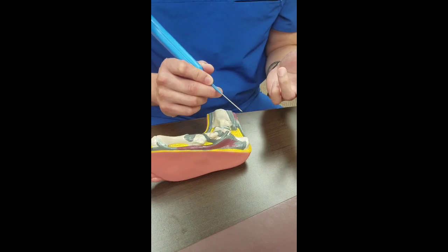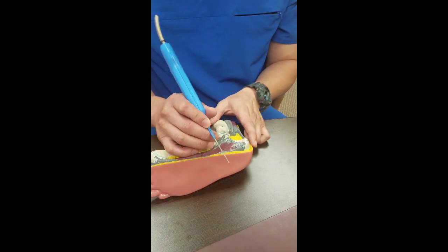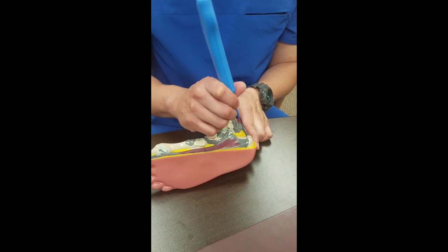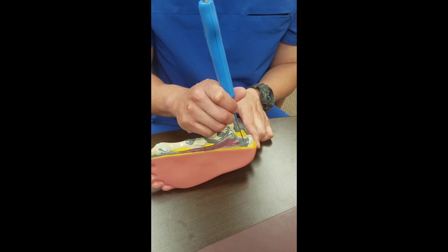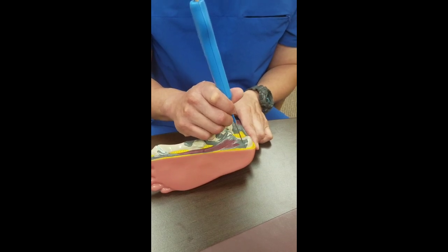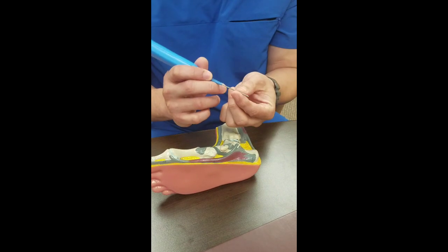So what's left behind is good, viable, non-inflamed tissue, and you can heal. Basically, we're just poking the inflamed plantar fascia, breaking up the scar tissue, and then sucking it out with this vacuum right here. It's all done within this one device.